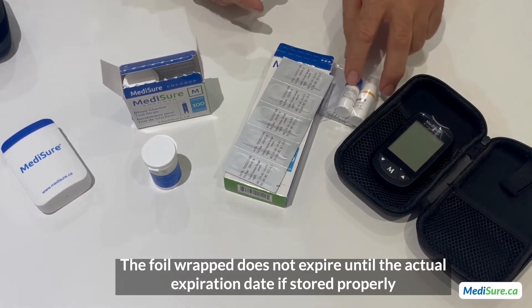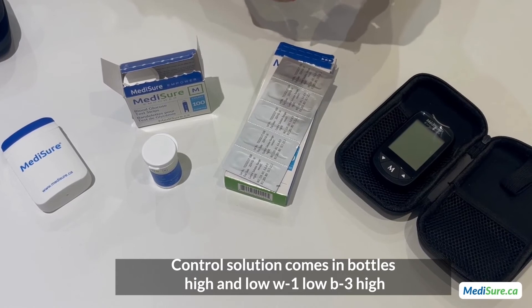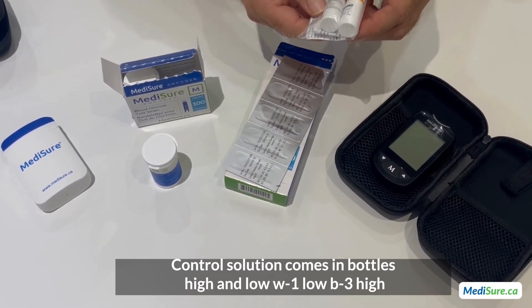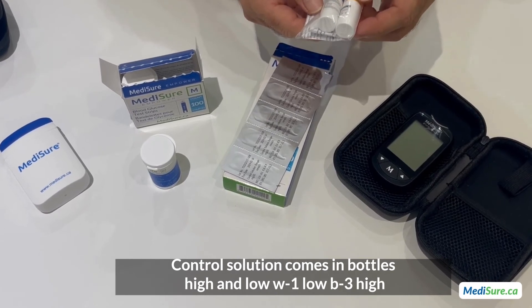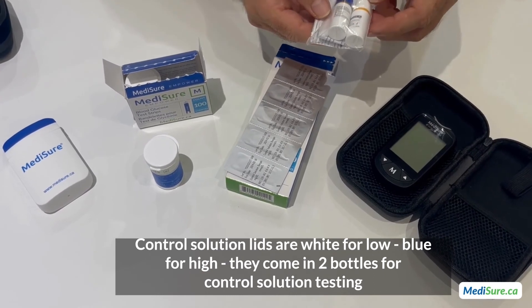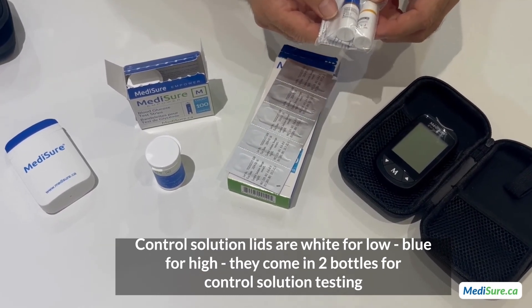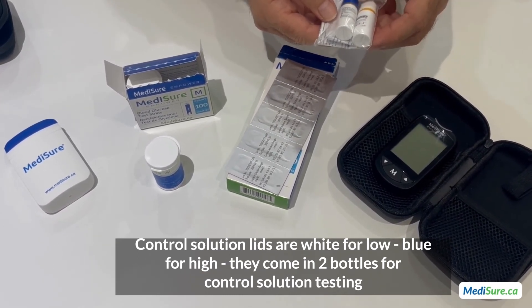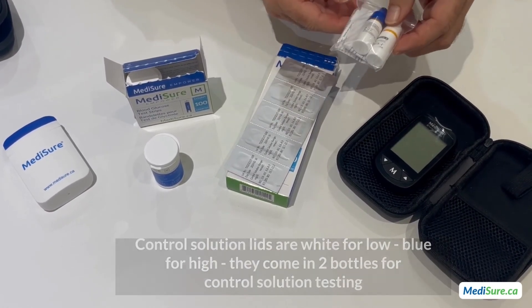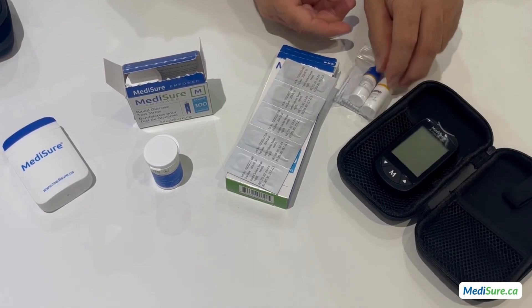The control solution comes in two bottles — a low bottle with a white lid, and a high bottle with a blue lid. These are labeled low W1 and high B3. The control solution comes in two bottles for use in control solution testing.